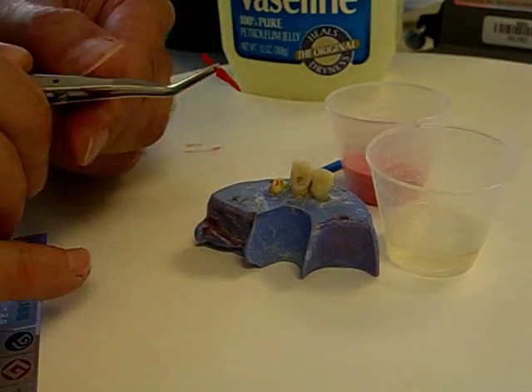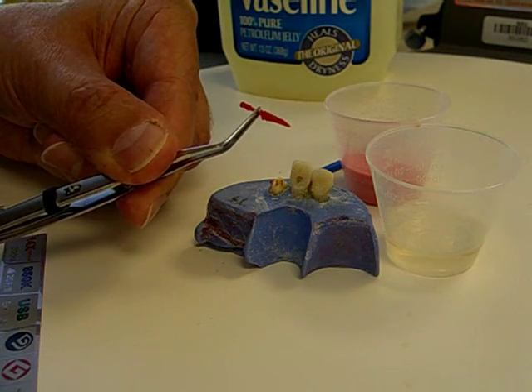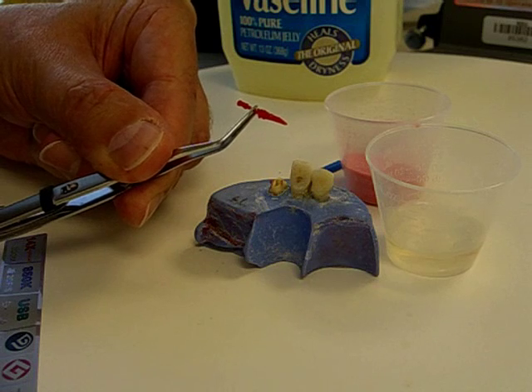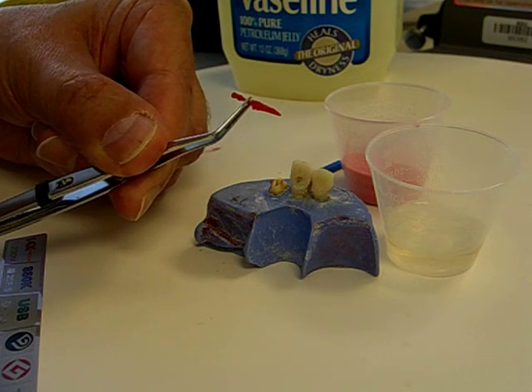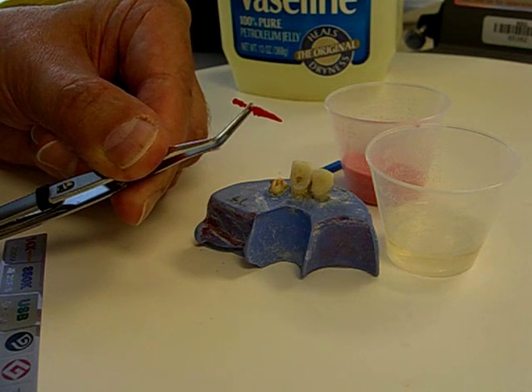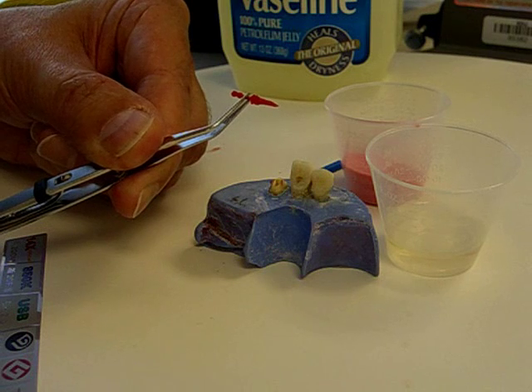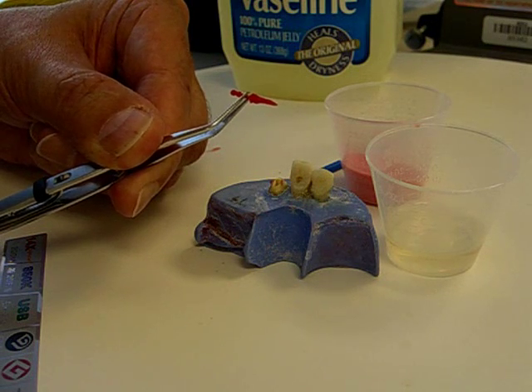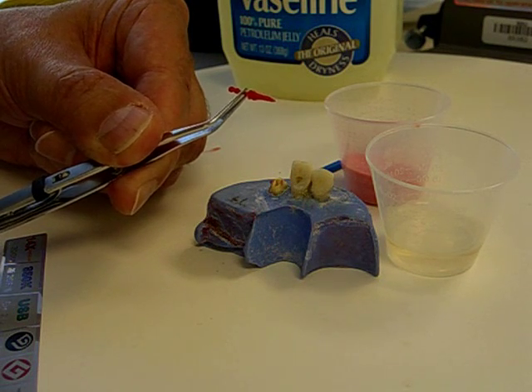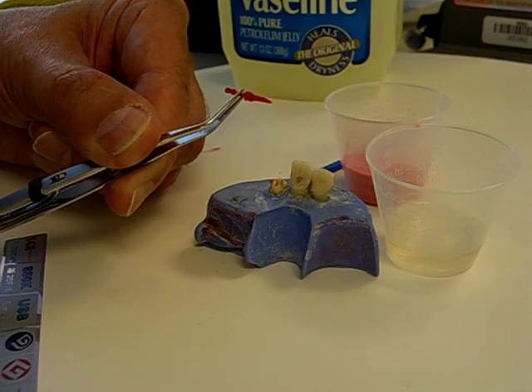And this is what it looks like. As you can see, I've captured the internal anatomy of my post space — one of the reasons I know that is I don't have any particularly shiny areas along the length of that pattern, and secondly, I don't notice any additional voids. The next step is to build up the core portion of my pattern.